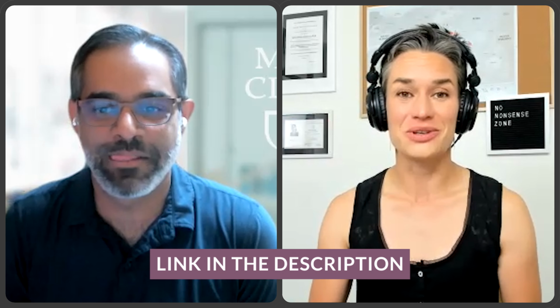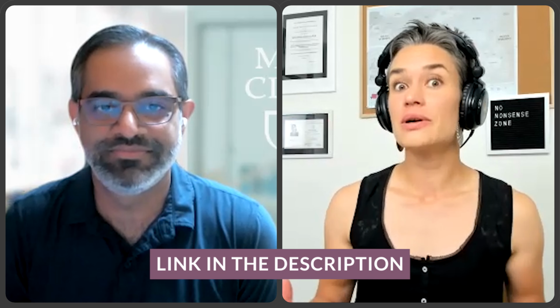How are you implementing them? What do you mean, what happens? Are you moving in that direction or not quite yet? I'm asking because you have departments that are working on those proofs of concept that end up as publications. And I know your work also ended up as a publication, and I'm going to link to the publication in the show notes. But in your organization, like you just said, okay, we did this, and you have gone beyond the normal visual validation.